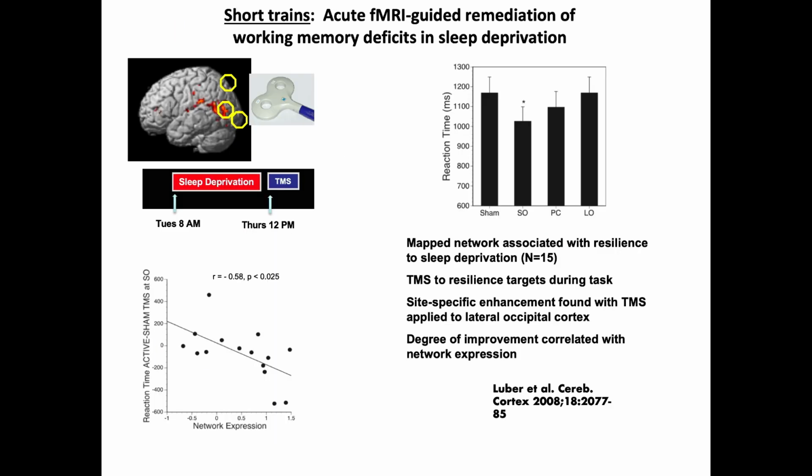behavior. And by the way, we're able to show that if we sleep deprive people for 2 days, here's a network that activated with the working memory task, and we stimulated inside that network these people that were sleep deprived for 2 days. We also stimulated outside the network, the same people, and stimulated that same parietal area. That's actually inside the network, but you can't see that from here.